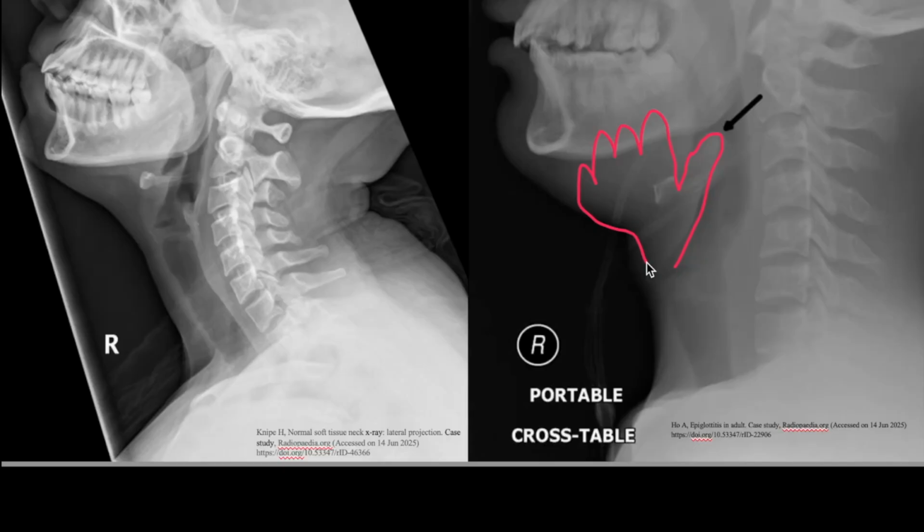That wraps up the upper respiratory tract anatomy ID list. Hopefully this helps reinforce how these structures relate in 3D space and how to find them on imaging. As always, think about both the anatomy and why it matters clinically.